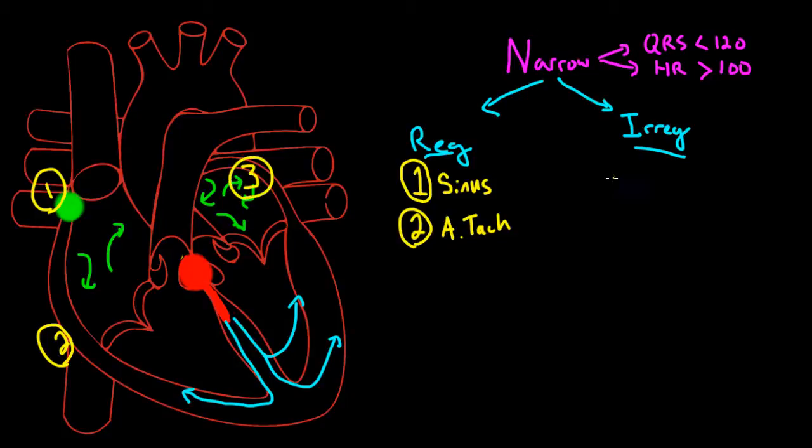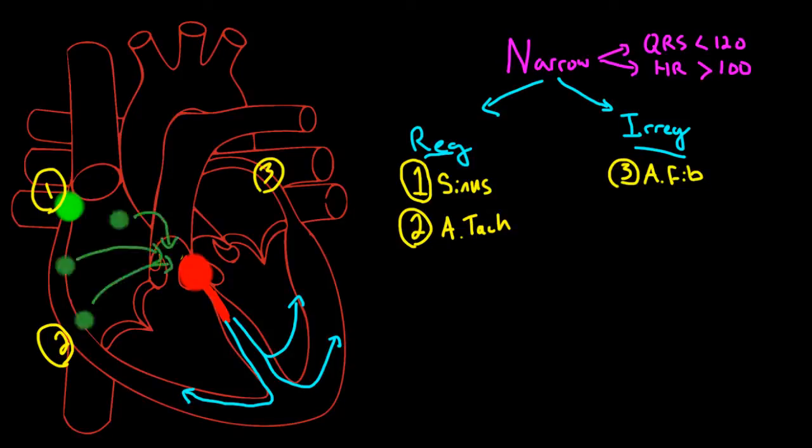Atrial fibrillation is an irregular narrow complex tachycardia. In AFib, the rhythm is completely irregular, and no P waves are seen. Multifocal atrial tachycardia is an irregular narrow complex tachycardia with at least three different kinds of P waves. It occurs because there are multiple irritable areas in the atrium that are causing ectopic beats at their own frequency. This is primarily associated with lung disease.